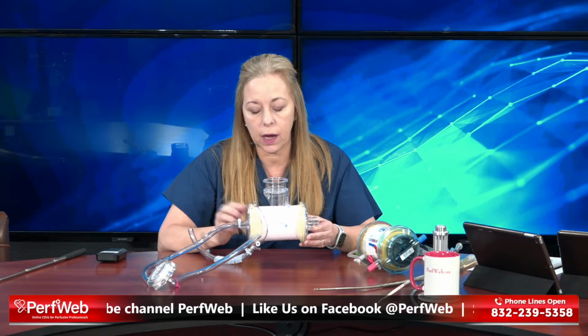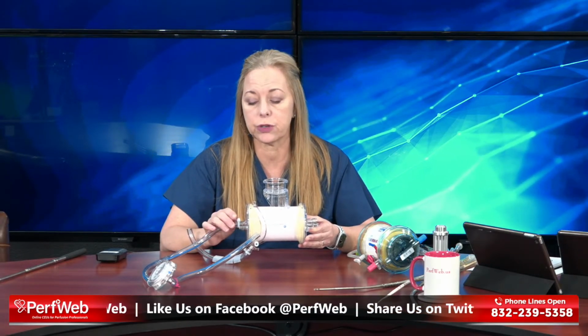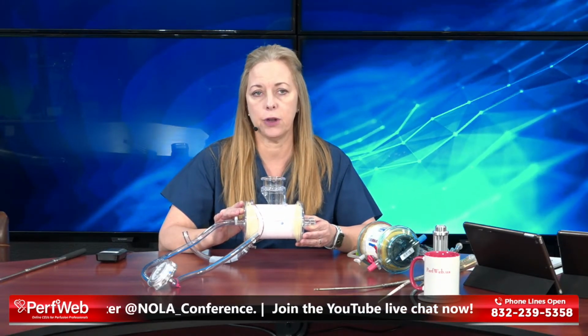You also need to be aware that if you have a patient that has extremely high lipids within their body, that's the same kind of thing that would react. So you want to just keep an eye on that. When it does have those interactions, it's not a sudden failure. You're definitely going to notice.